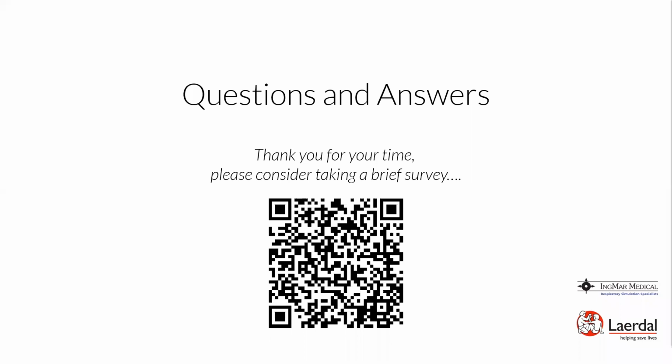This is Lars Erik here, just translating the German question. It's about software, whether the user has to update the LEAP software in order to run these scenarios. Actually, that's technical. I wouldn't be able to answer that. Does anybody know that? Yeah, LEAP software 6.3 or later is required for use with the SimMan mannequins, and if you want to use it with the SimBaby, then LEAP version 6.7 or higher is required to use this ASL 5000 lung solution.